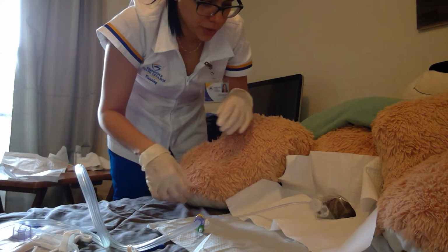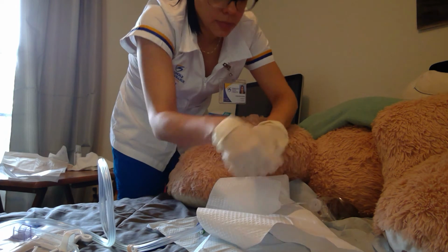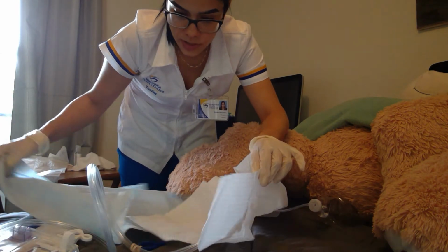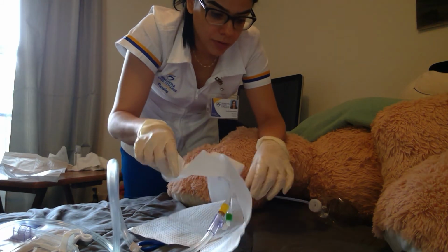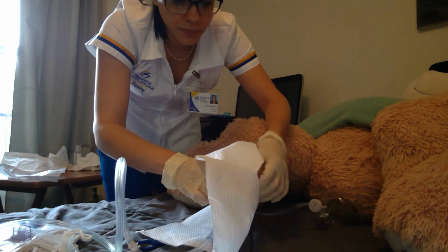And I am going to take this out. You want to tear it, you want to break it, but I'm not going to do that for this video. I'm just going to take it out. But in a real environment, you just want to break it and throw it away, okay?